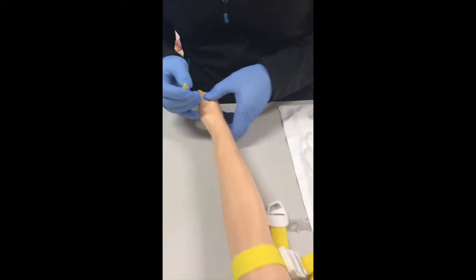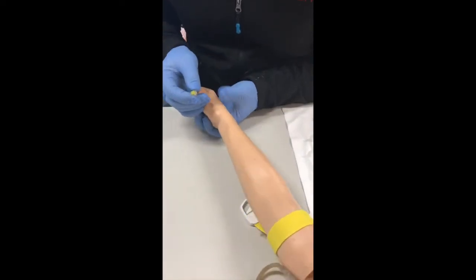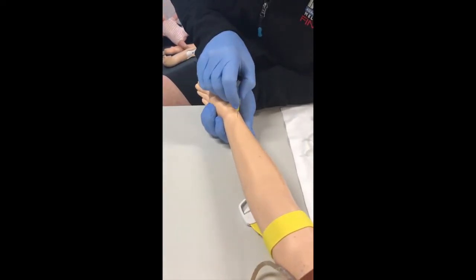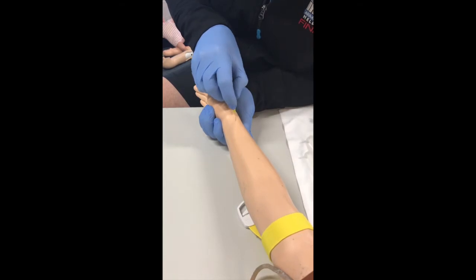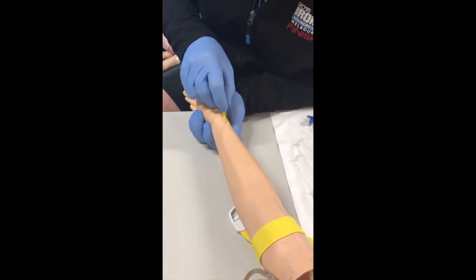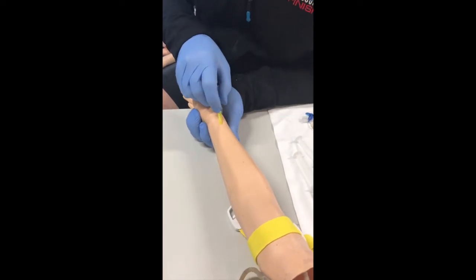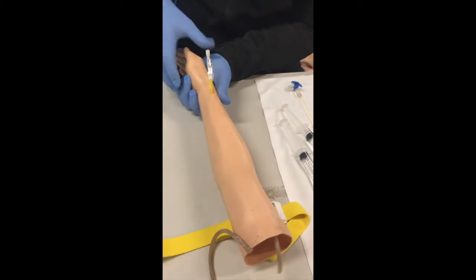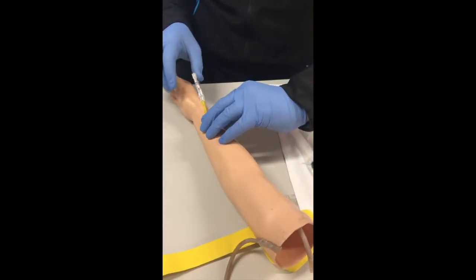When I'm ready to cannulate the patient, I alert the patient that there's going to be a sharp scratch or a sharp prick prior to insertion of the cannula. At a small angle, no more than 10 degrees for a paediatric, I advance the needle through the skin until I get flashback into my cannula. I advance the needle 1mm more, no further, as the paediatric has small veins.